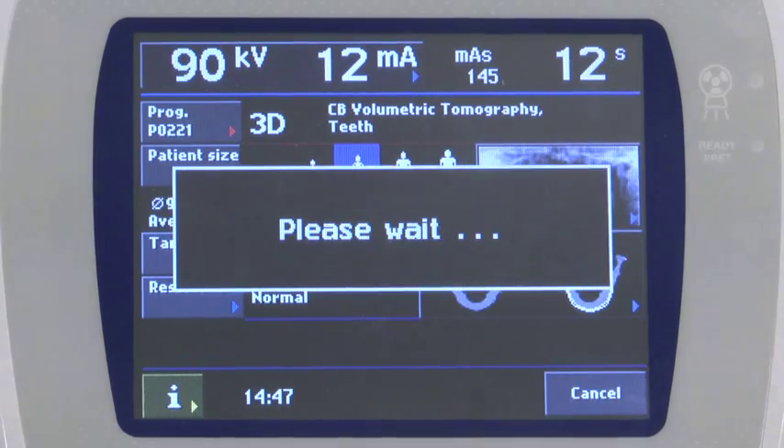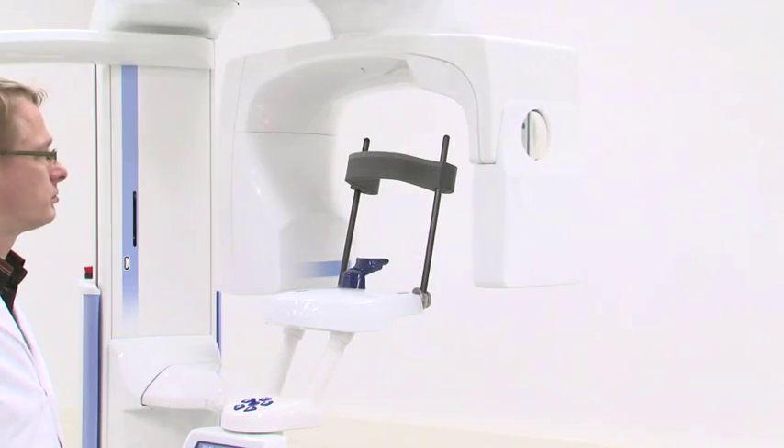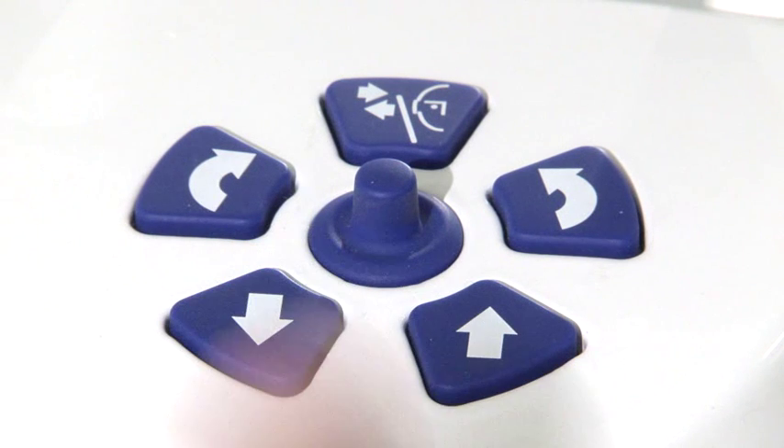Select the Go3D button to put the Promax into the selected position. The rotational arm will move to the proper patient entry position. Use the up and down buttons to raise or lower the machine to the appropriate patient height.